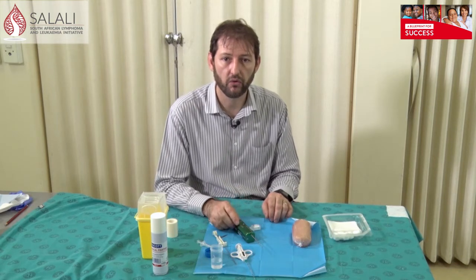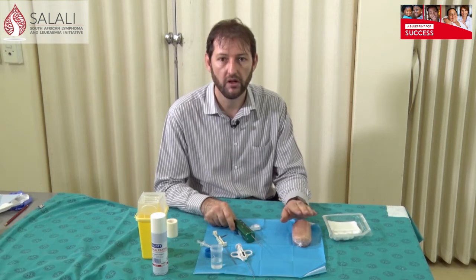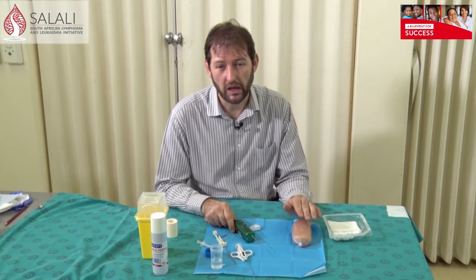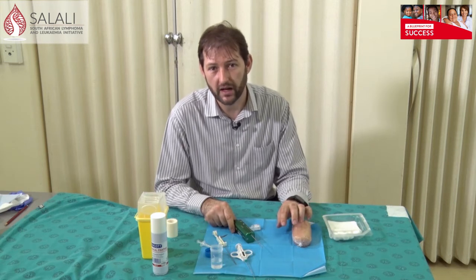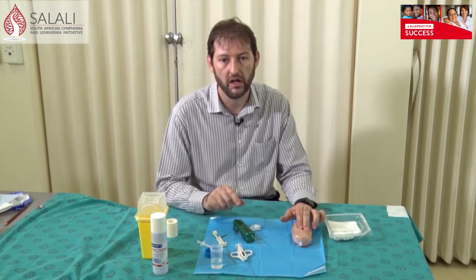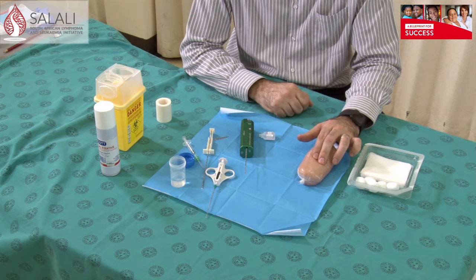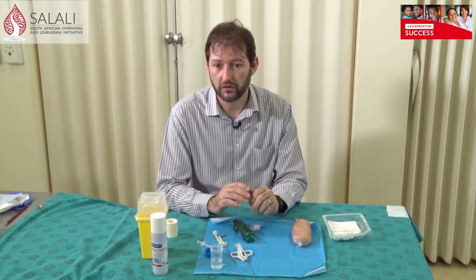After you are done with a biopsy, apply some pressure on the wound — you do have more bleeding with core needle biopsies than with fine needle biopsies. Remember, the area where you apply pressure is not necessarily where you've made your cut in the skin. Think of where you've actually taken the biopsy and apply your pressure there — that might be two or three centimeters away from your skin incision. Just apply pressure for a couple of minutes and the bleeding will stop.